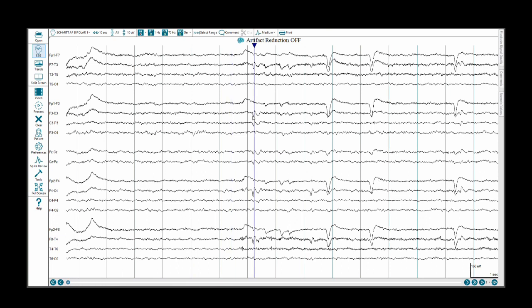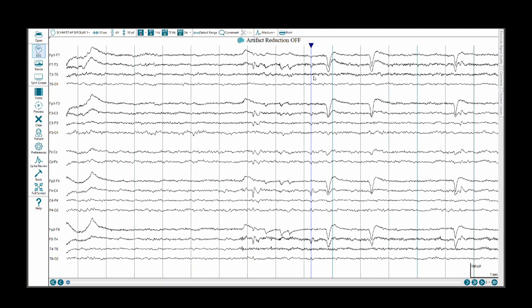Right here we see what appears to be a spike and then an after-going slow wave, which is a signature of an epileptiform discharge. One of the signatures. We also see one right here, but the polarity we are going to try to make sense of. First, let's switch this to a referential montage and see if that makes a difference.